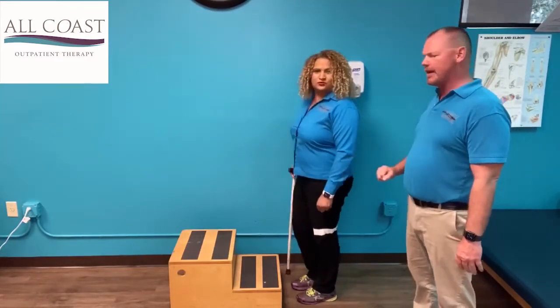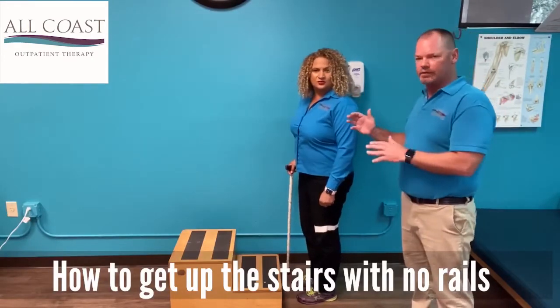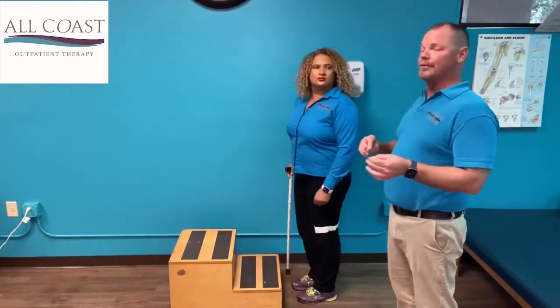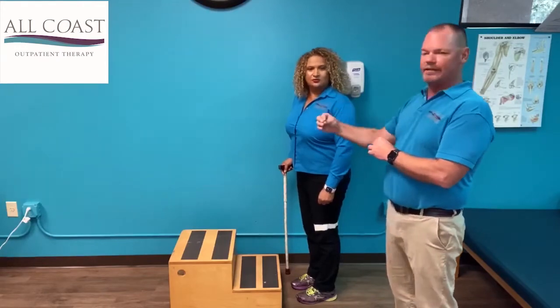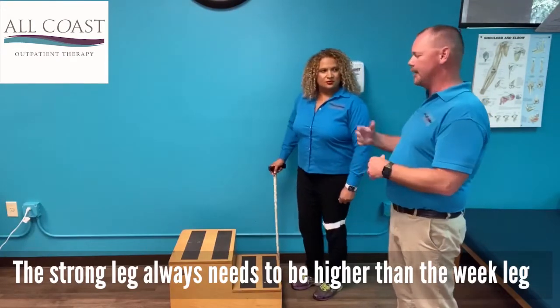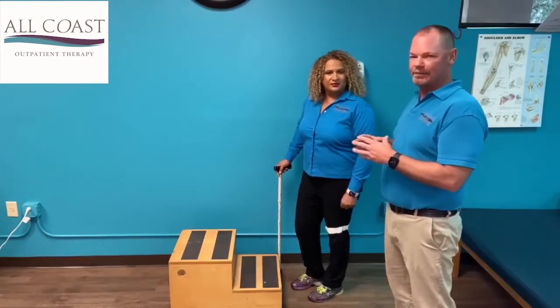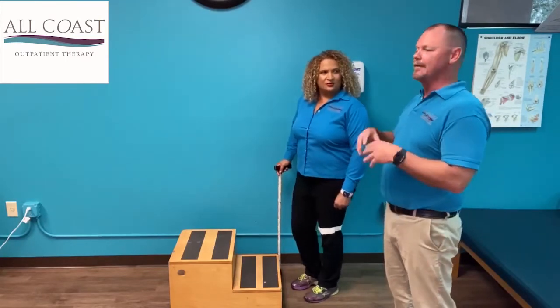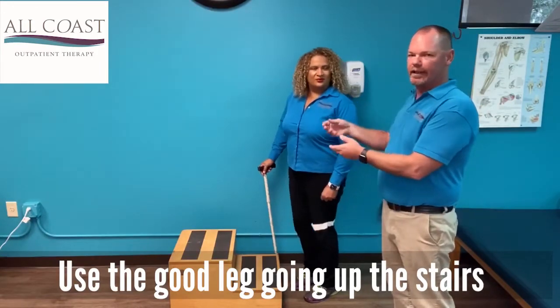We're going to demonstrate this with no rails — how to get up with no rails. The most important part to remember is that the strong leg always needs to be higher than the weak leg. We always like to say in physical therapy — I've probably said it a million times over the years — something to help you remember is 'the good goes to heaven.' So when you're going up the steps, you lead with your good leg.